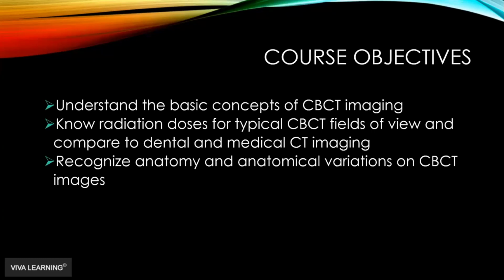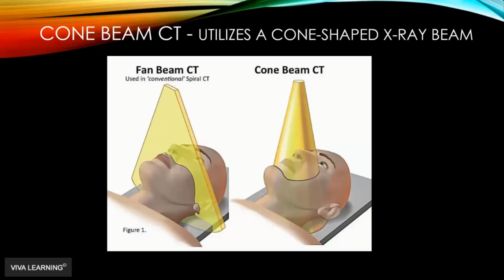And the course objectives obviously follow that. We want you to be able to understand the basic concepts and recognize anatomy on CBCT images.